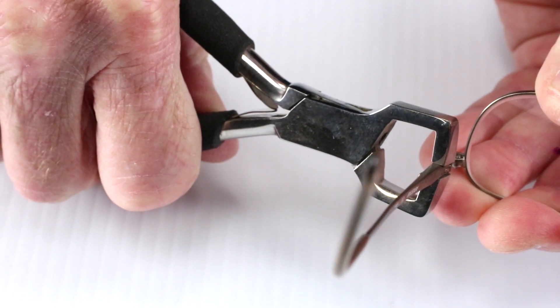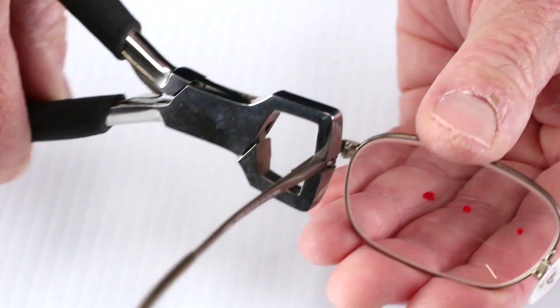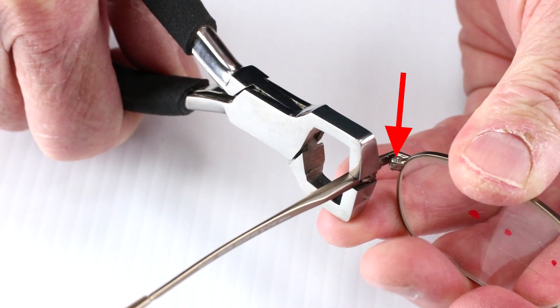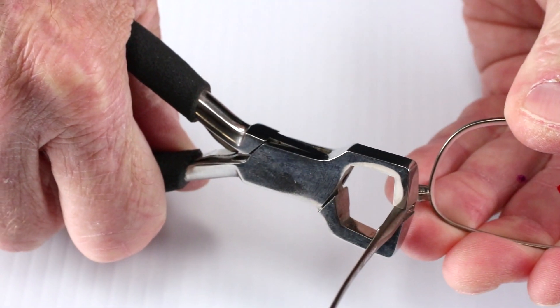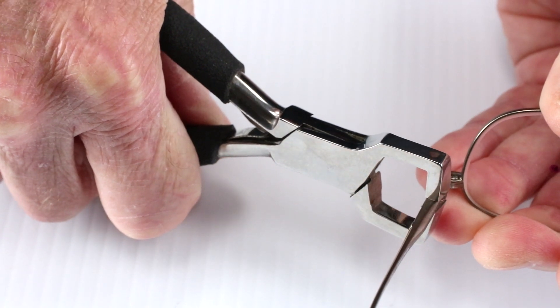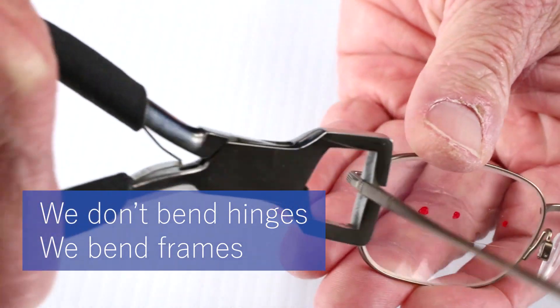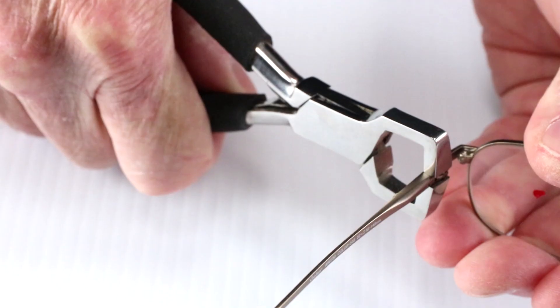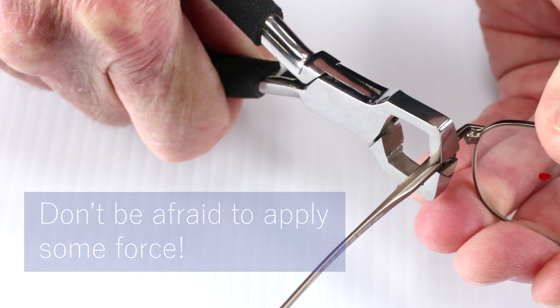Also, notice how it is designed with a smooth finish and soft edges to reduce the risk of frame damage. When properly positioned, the plier supports the entire hinge assembly, protecting it from damage and assuring that we are adjusting where we want — the frame at the chassis end. Now, this is everything when we're talking about this pair of pliers: we are adjusting the temple at the chassis end. We are not adjusting the hinge. We do not bend hinges. We bend frames. So, just like our other tools, don't be scared to grab and squeeze these pliers.